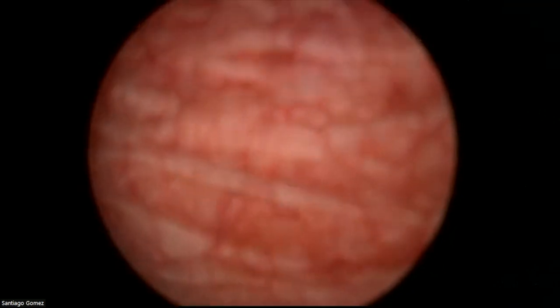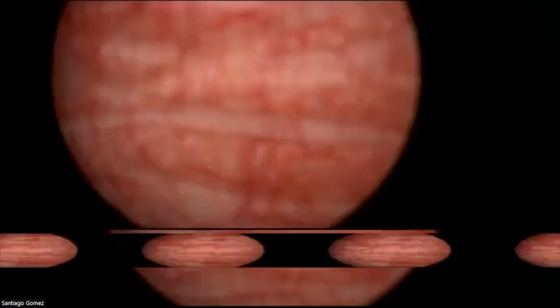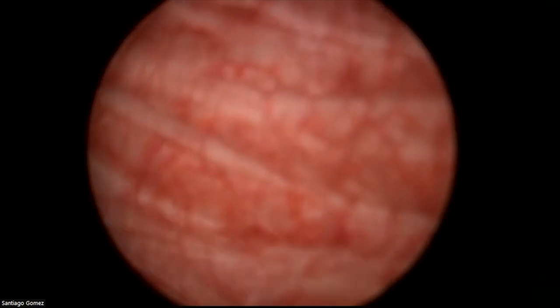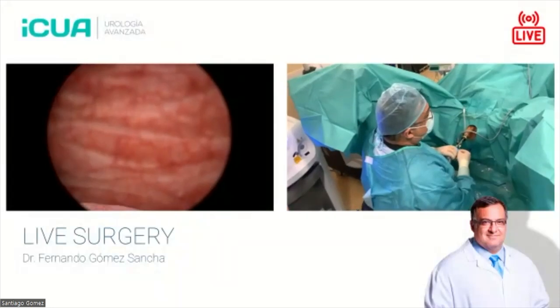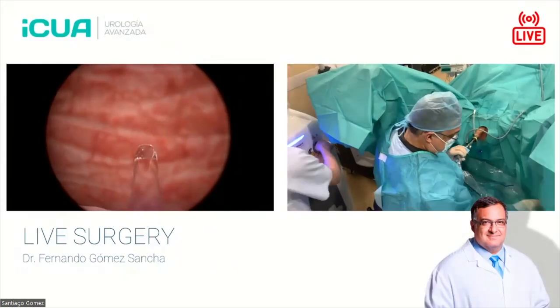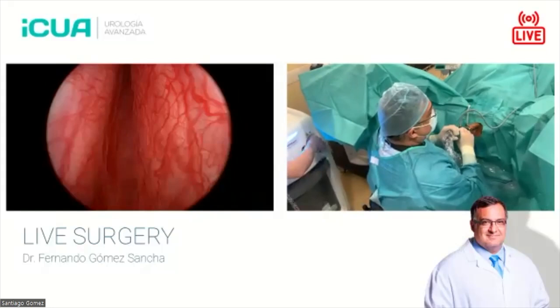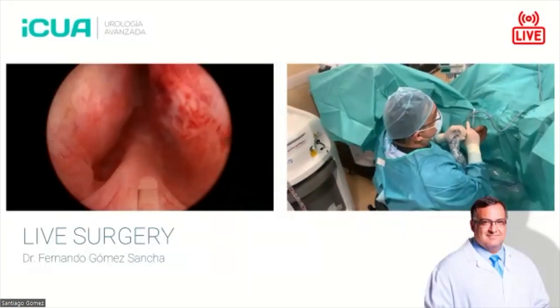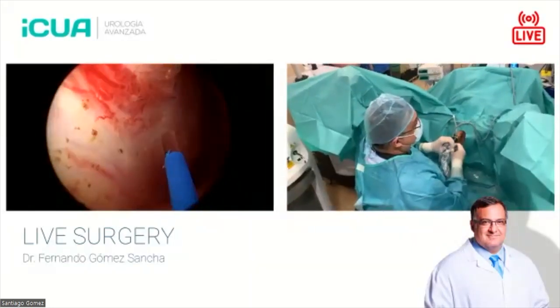So I'm going to start putting the fiber inside. As I said, the settings are not the only determinant of tissue effect. You see that the camera is a little bit out of focus. Do you see the endoscopic image? Yes, perfectly. Brilliant. So I'm going to show the en-bloc technique, and I will start at the apex. So it's important to come out like this, you see, and recognize where is the limit of the sphincter with the adenoma. You can see this line here.